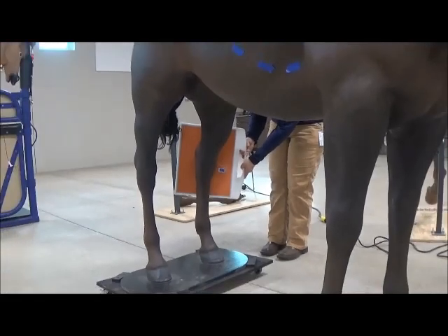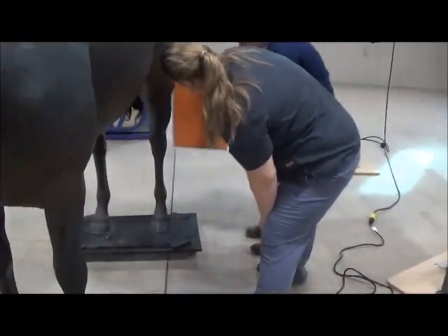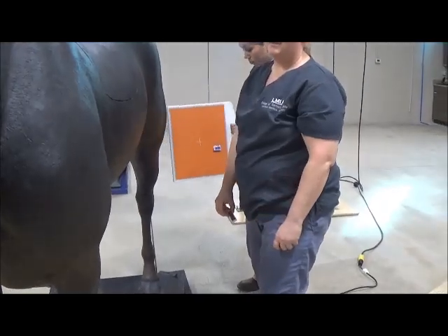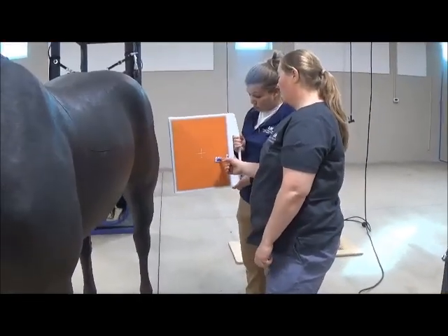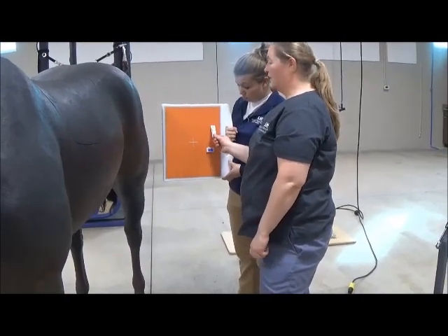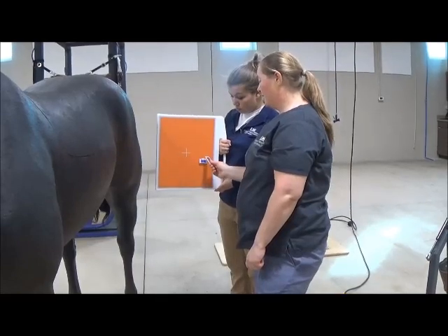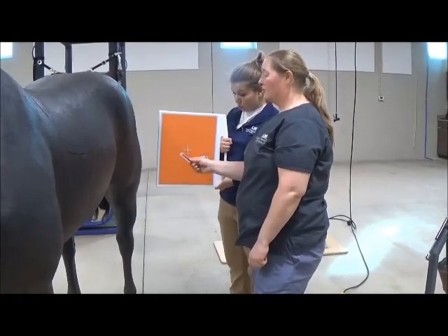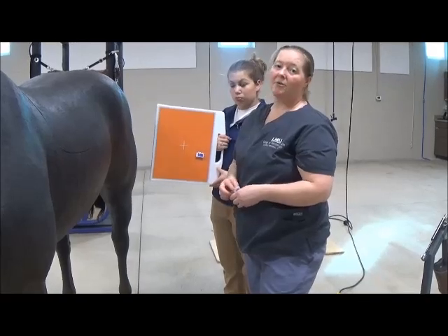And then if you wanted to use your other markers, then you would just place those on when you do your two obliques instead of moving. So what you could do is potentially not move your left marker and just put this on to label that view. Although if you're going to be a purist, then you would still move this, so it's always dorsal and always lateral. And that is how you label radiographs.